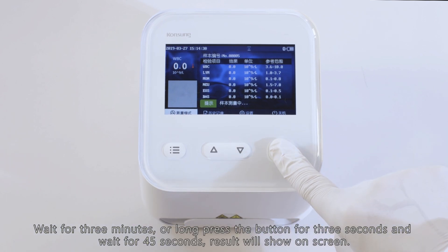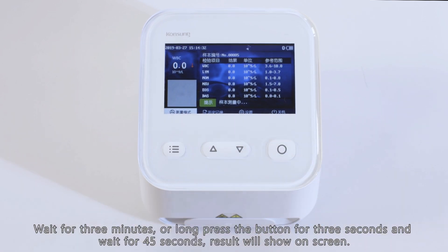Wait for 3 minutes, or long press the button for 3 seconds and wait for 45 seconds. The result will be shown on screen.